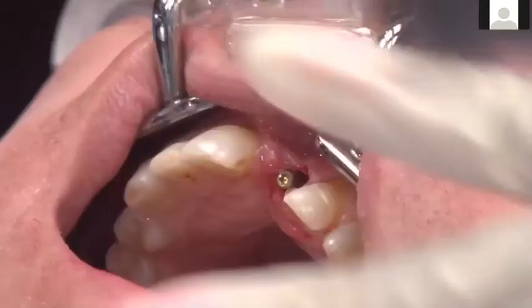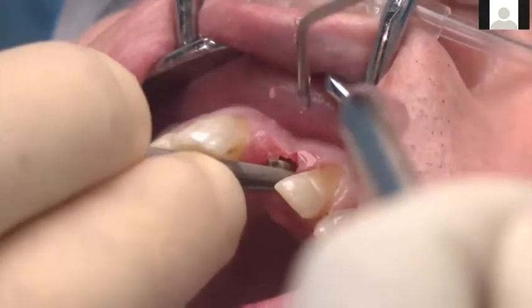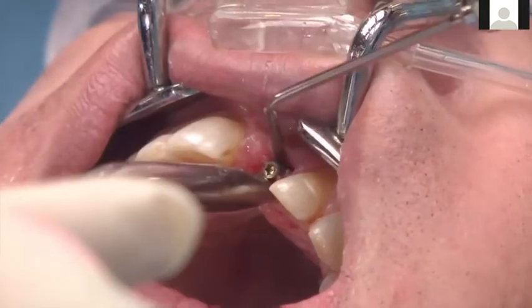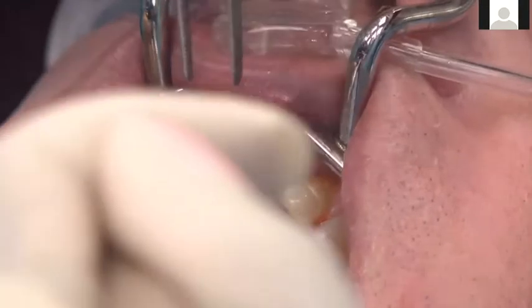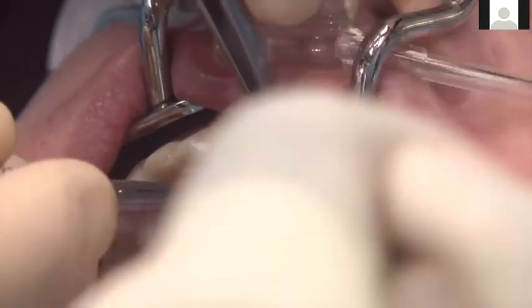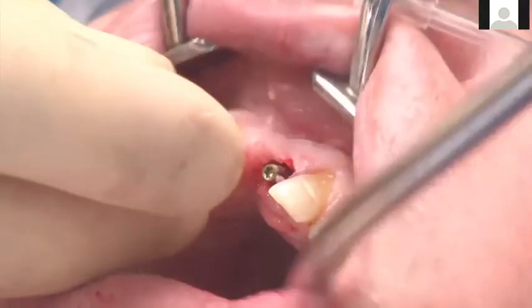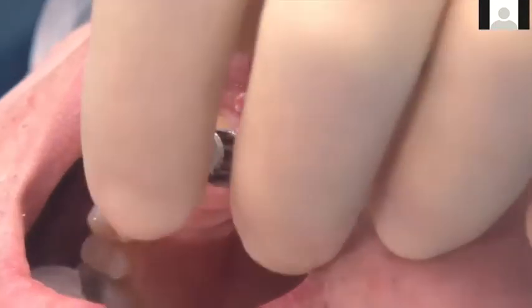You can see here sometimes you've got little tissue tags that you can then either just pull out with a pair of tweezers or just use a little blade to then remove those little tissue tags if they do remain after this profiling. So here you can see this is the little blade that's used just to kind of remove that little tissue tag, and nothing major here. And then at this point, then you can go ahead and remove this little direction indicator pin.